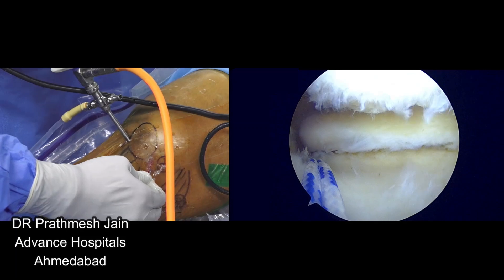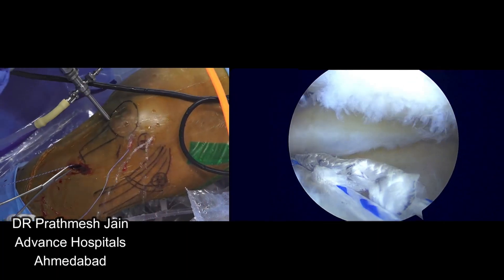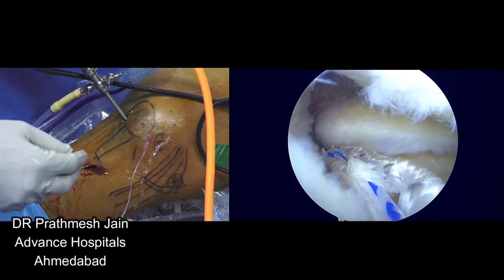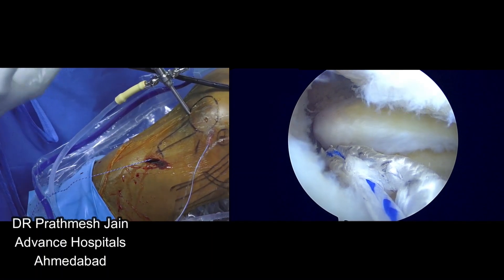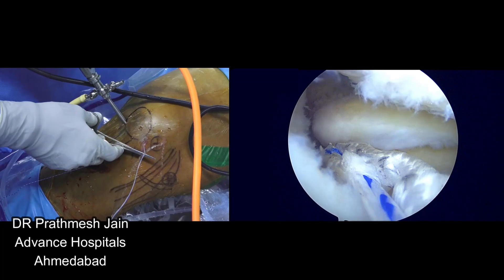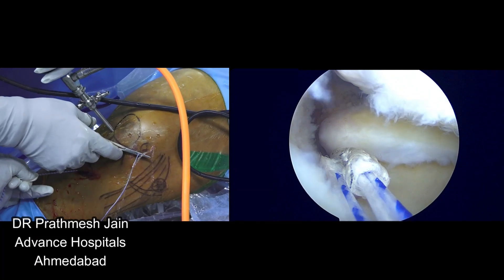You can see that the anchor is going into its place nicely. The anchor is right there and you need to pull this anchor onto the footprint. Occasionally if you pull it very hard, this anchor may come out from the tibia. A very good trick is to put your artery forceps here so that you don't over-pull it and the anchor does not come out into the tibia.